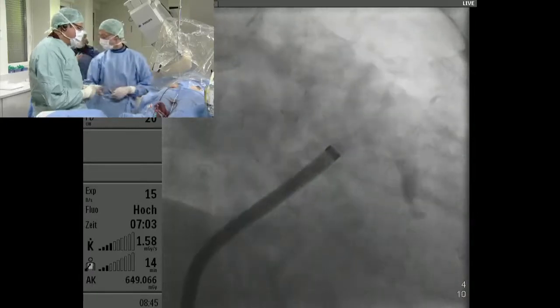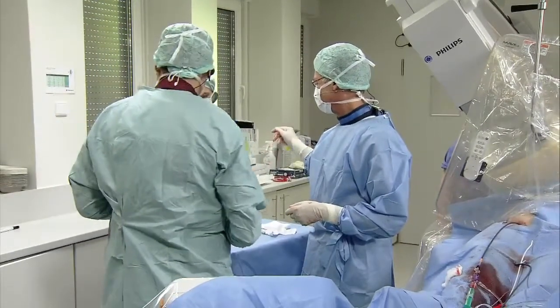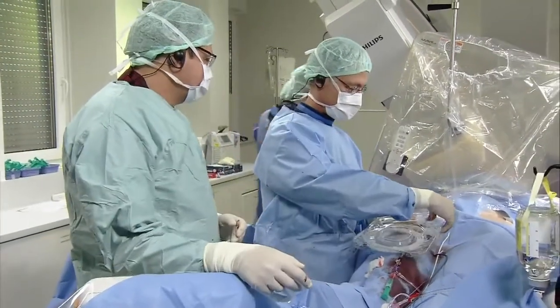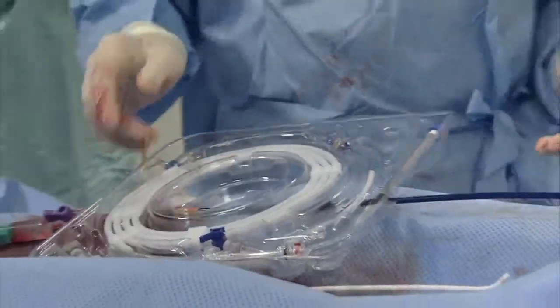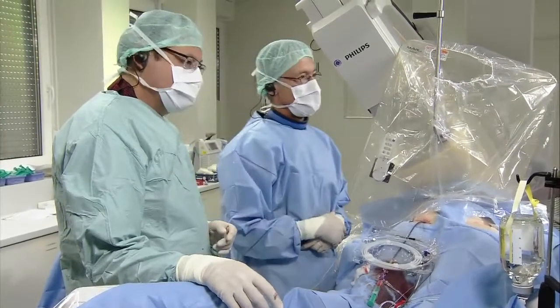Okay, so let's prepare the 25. Not exactly. But before you go, I mean, you're looking at it angiographically. How about if we look at it on echo? And see where maybe you are not in the position where you think you should be ideally. Big syringe. Bushra?